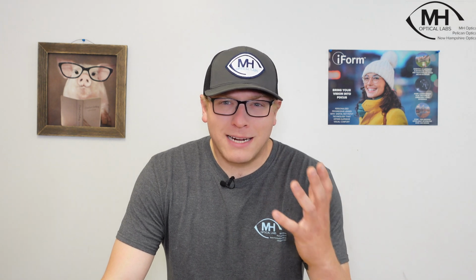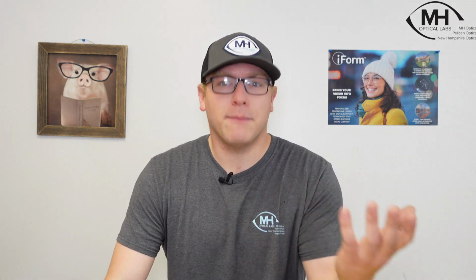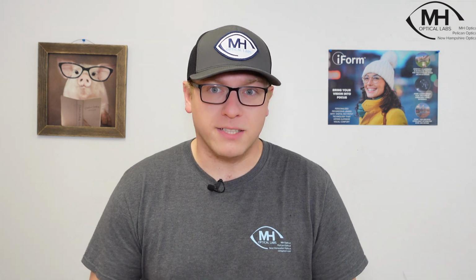Now, this is something that I don't think is really talked about at all, or people may not understand. It actually took me a little bit to understand it myself, or how to demonstrate it for that matter. The first step is understanding that surface lenses are very different than stock lenses. With stock lenses, your OC is always in the center of the lens, never decentrated left or right. With surface lenses, it is a custom lens for that job, for that frame, for that patient every time.